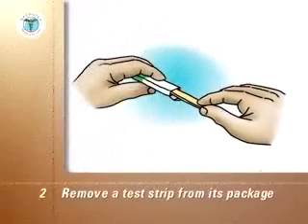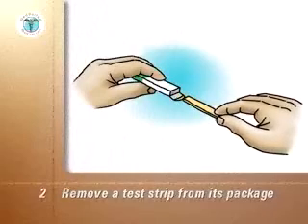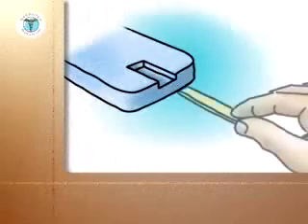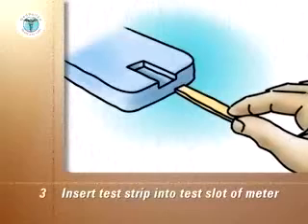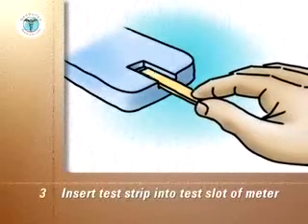Remove the test strip from its individual package. With the meter off, insert the correct end of the test strip into the test slot of the meter, according to the manufacturer's instructions.